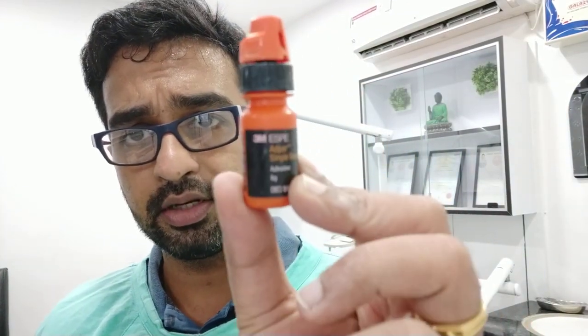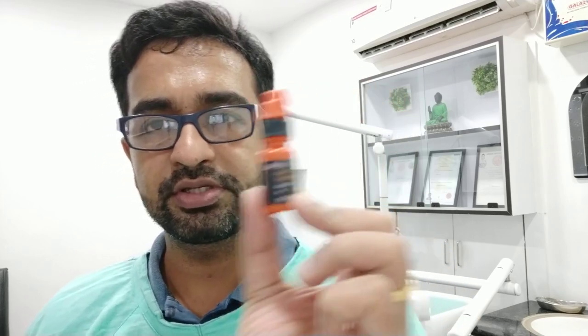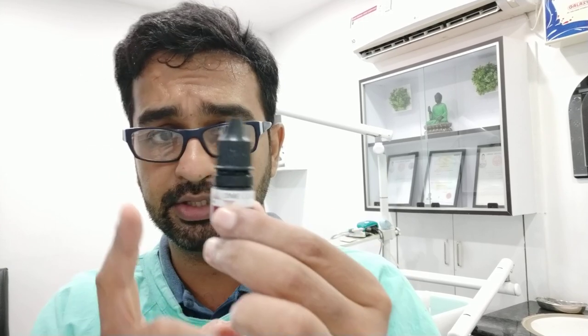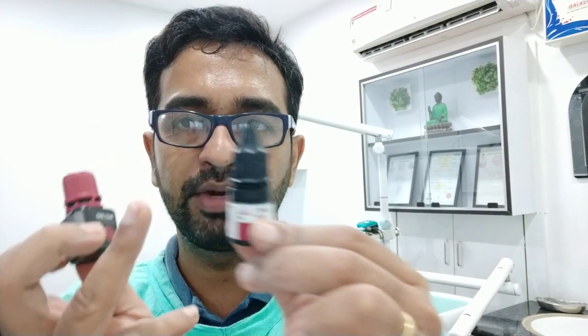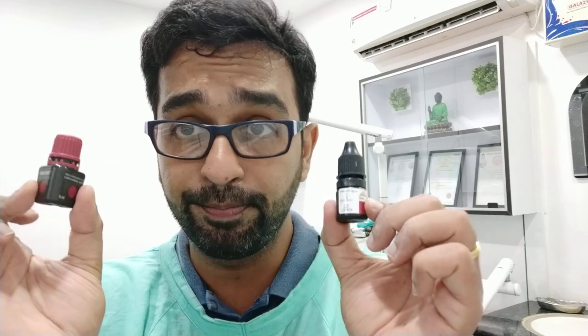Now I want to talk about bonding materials. Earlier I was using 3M Adper Single Bond 2, which is a 5th generation bonding agent. Now I am using 1 Coat 7 — a 7th generation bonding agent. Coltene changed the packaging because the material was leaking. The cost is around 3,500 rupees — very expensive — but it saves a lot of time. Normally you etch the surface, dry it, apply bonding agent, then put composite, which takes a lot of time.